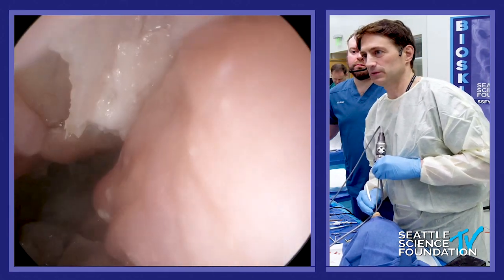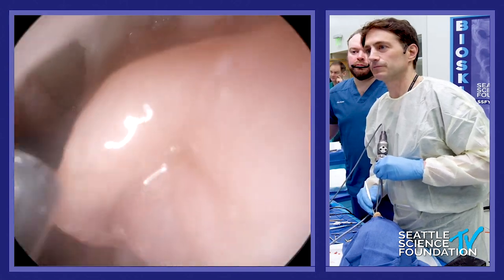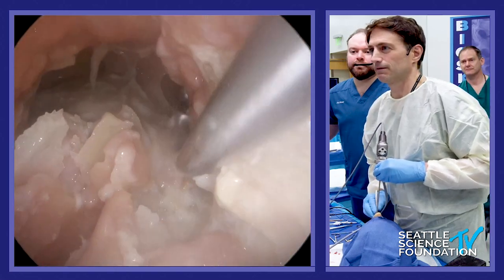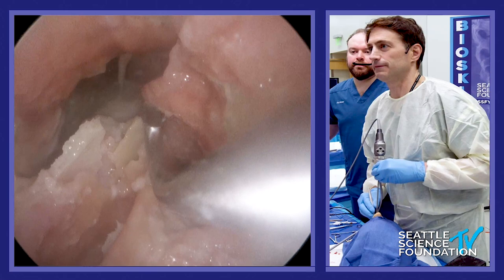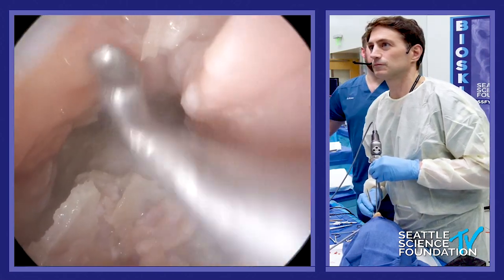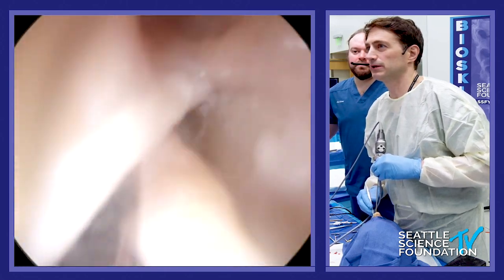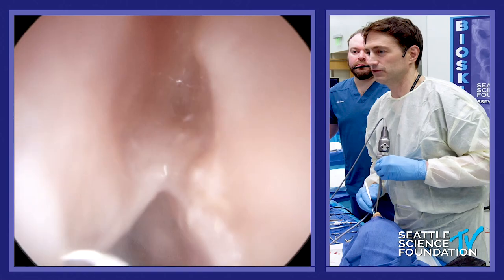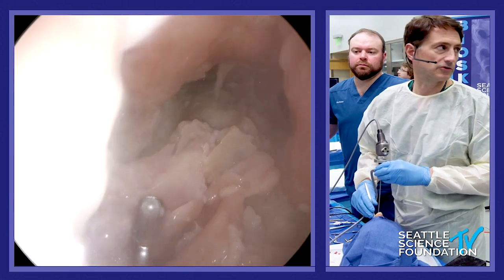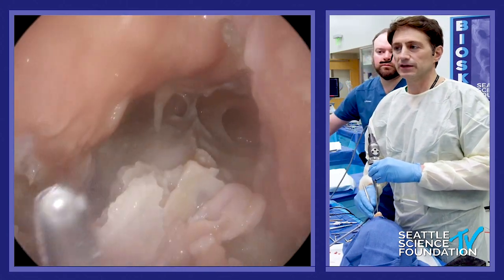We want to cover as much of that bone as we can, anteriorly as well. It's torn right there, but you get the idea. Thanks for making that look easy. This goes right here — make sure you bring this all the way. See how this covers that whole area now? All this is covered with mucosa. Now you're going to put various things here — I've tried different things over the years. You can use Propel Minis.